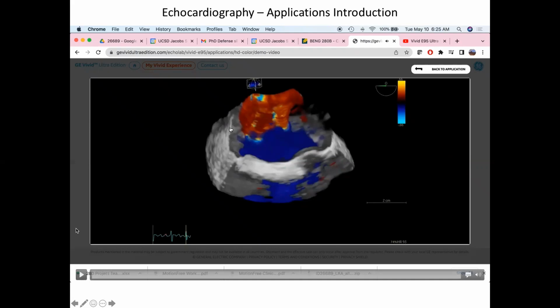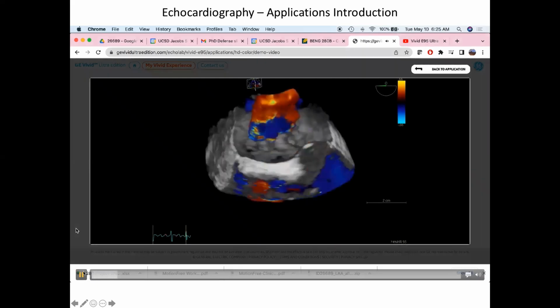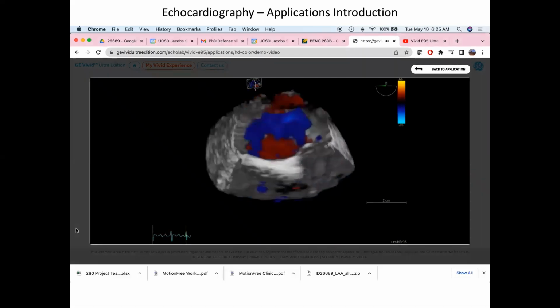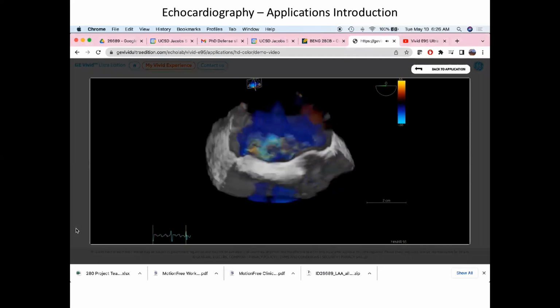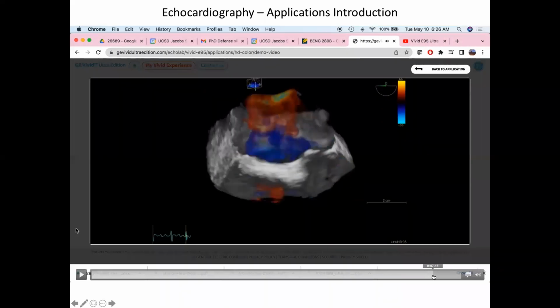So you're taking a 3D echo image. So we're sweeping now to get the 2D plane, and then you sweep back and forth to get the 3D plane, and then you turn on Doppler, and so you get basically a 4D velocity field, right? And one of the problems they were having is that when you do the color map, it obscures your view through the object, right? And so now in this application, they've put real-time volume rendering with transparency on this thing. I think it'll go, yeah. So this is the old type, and it's going to sort of fade into this new volume rendering, such that you can still see this jet at every phase of the cycle.